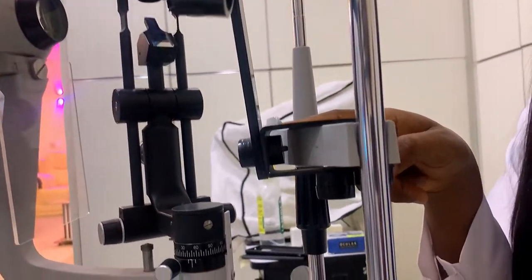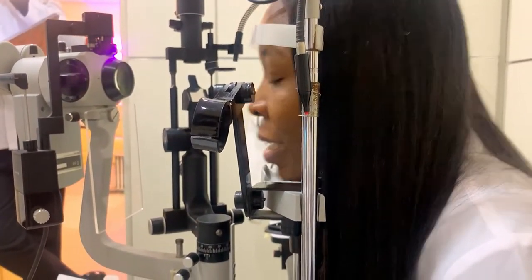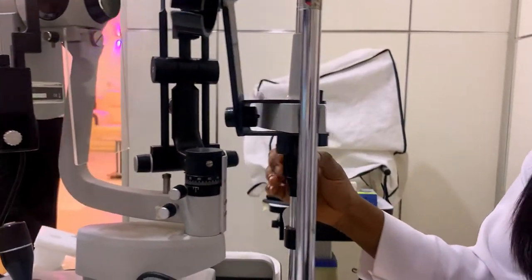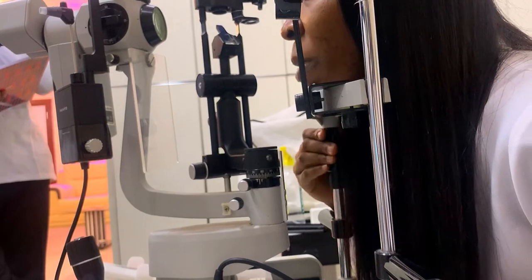Next is the chin rest. This chin rest is for proper placement of the patient's chin during the patient preparation for your slit lamp technique. After this chin rest, next is the chin rest adjustment. This chin rest adjustment is what enables you to take down or take up the chin rest when you're setting your patient.